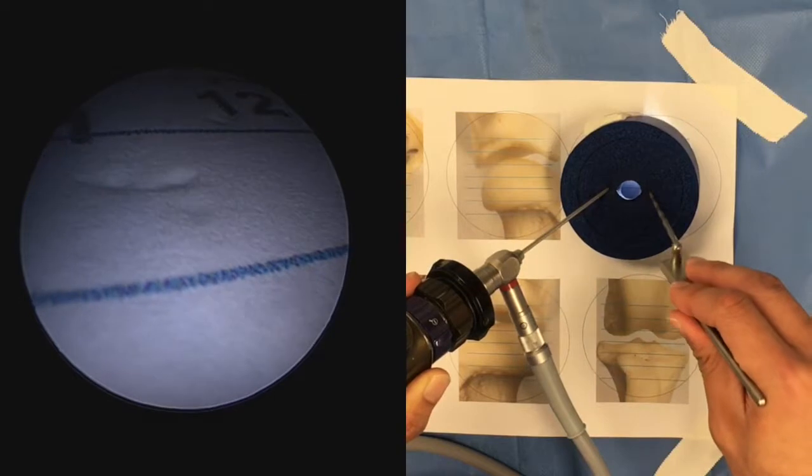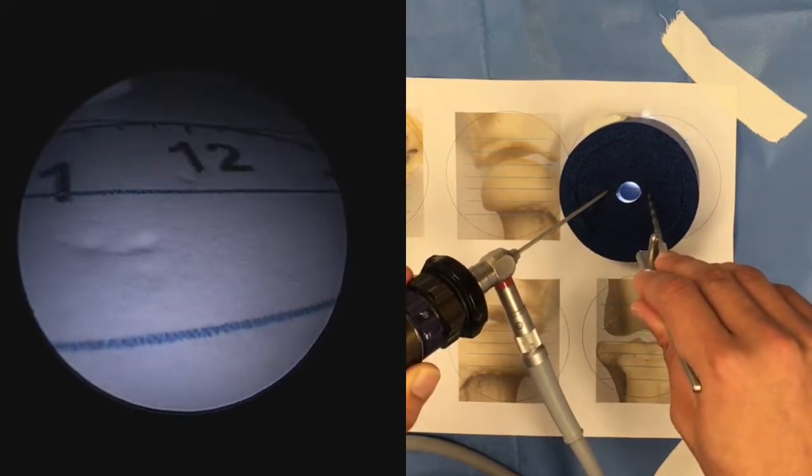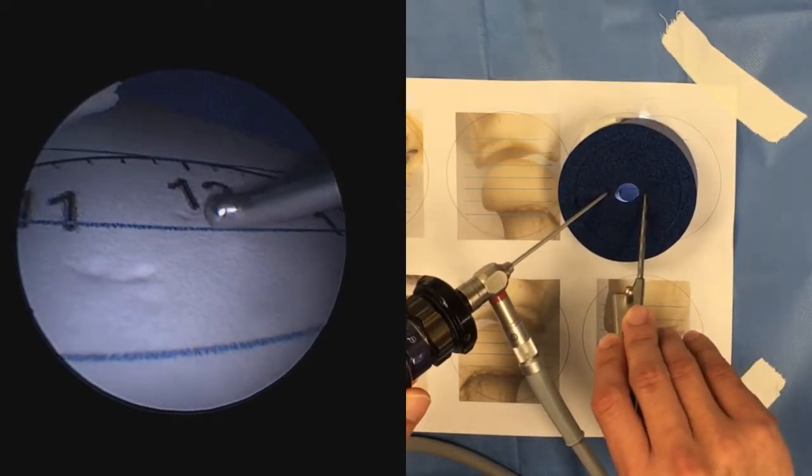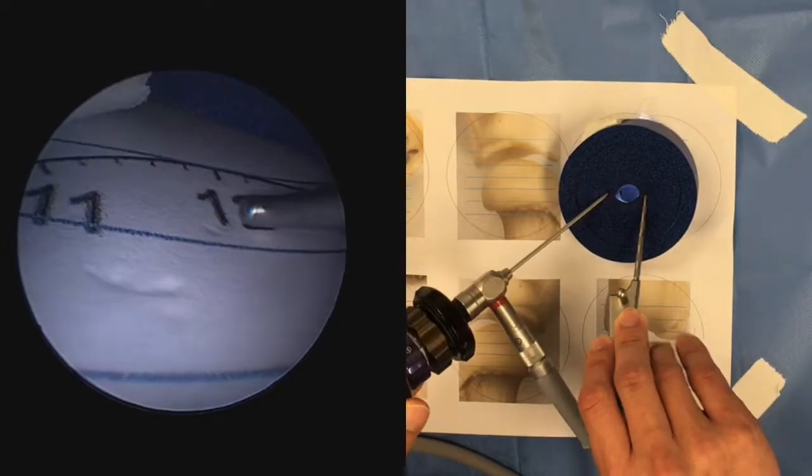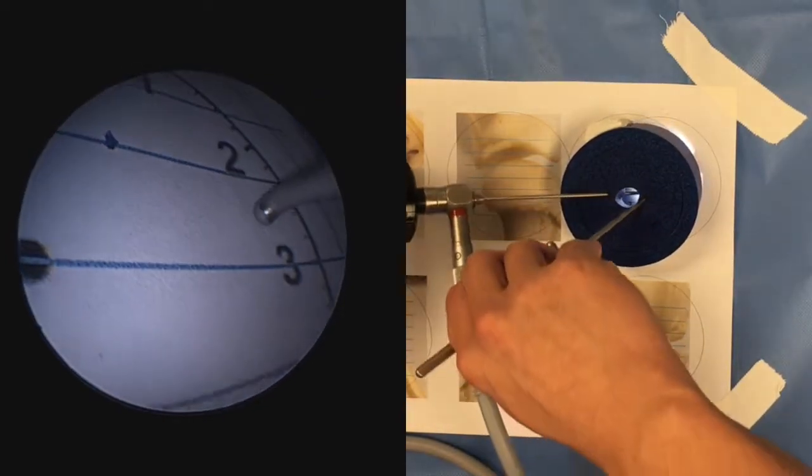If we can't find our tip, back out a little bit with the scope. Then it should be easier to find the tip of the instrument.